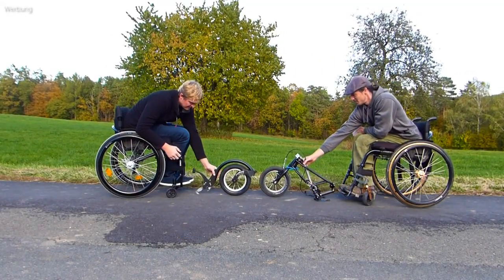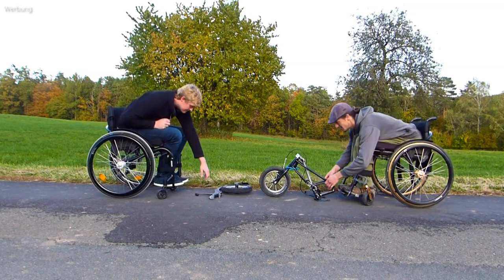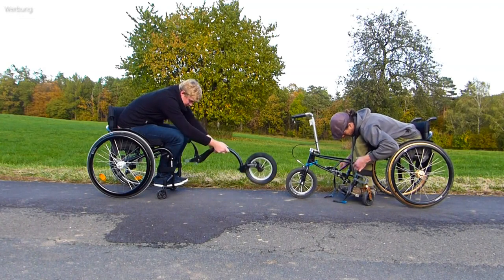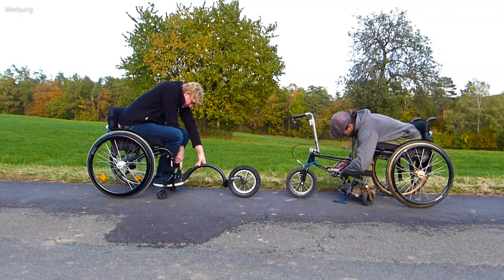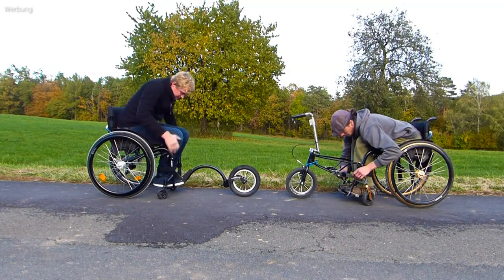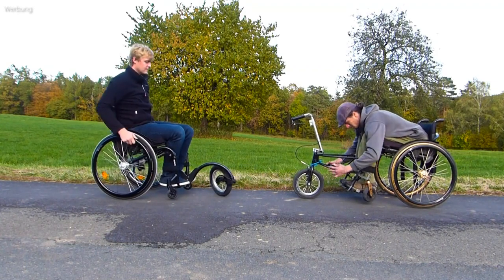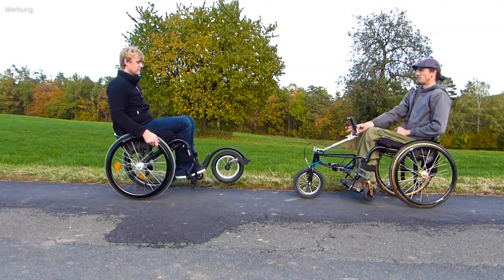Let's first look at the coupling and uncoupling to the wheelchair. This is pretty quick with both bikes. With the Fossara there are a few more steps, but this allows a significantly higher stability to be achieved.